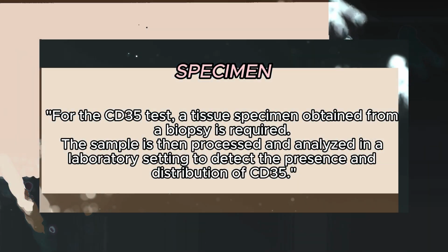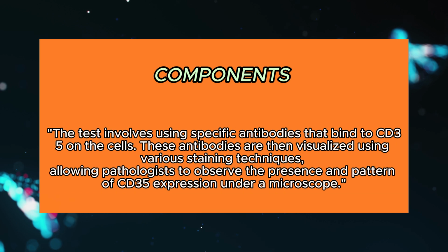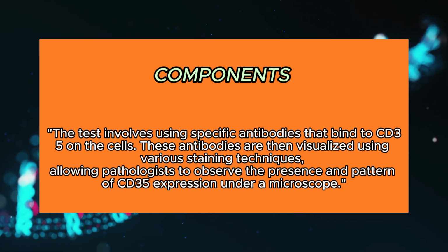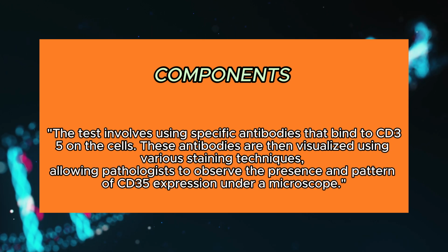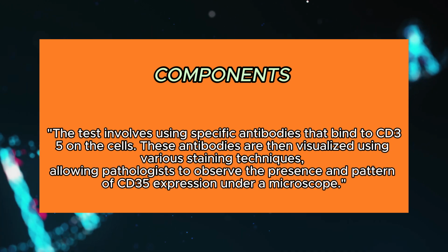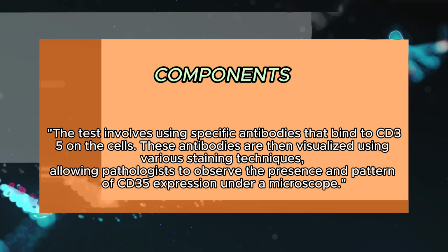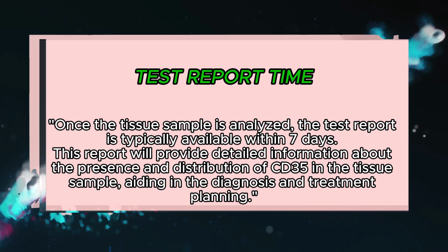Components included. The test involves using specific antibodies that bind to CD35 on the cells. These antibodies are then visualized using various staining techniques, allowing pathologists to observe the presence and pattern of CD35 expression under a microscope. Test report time.